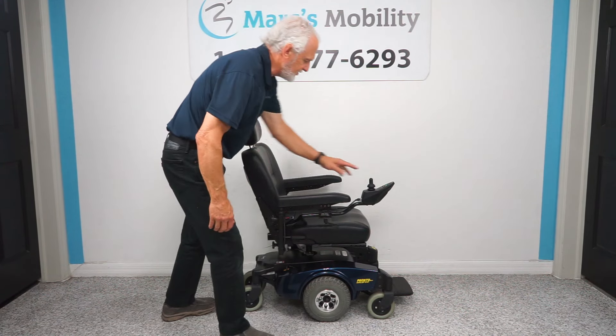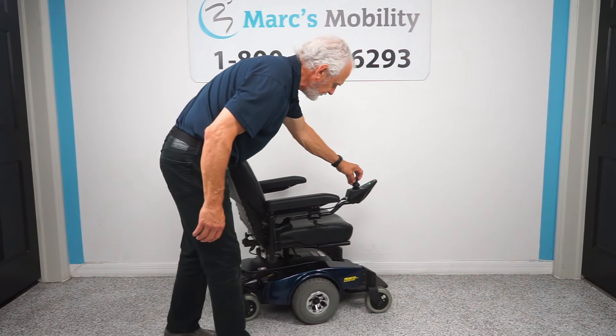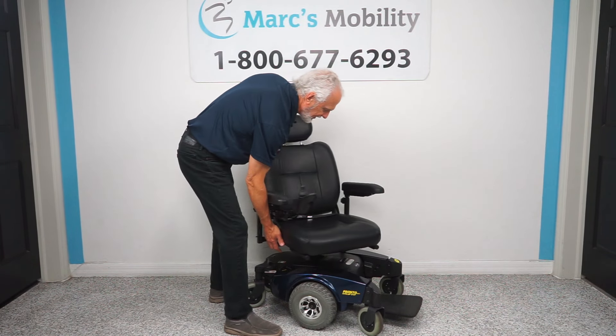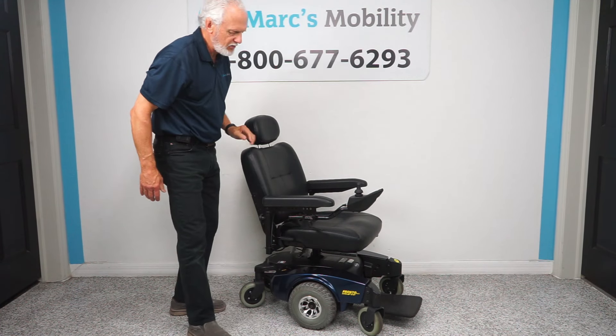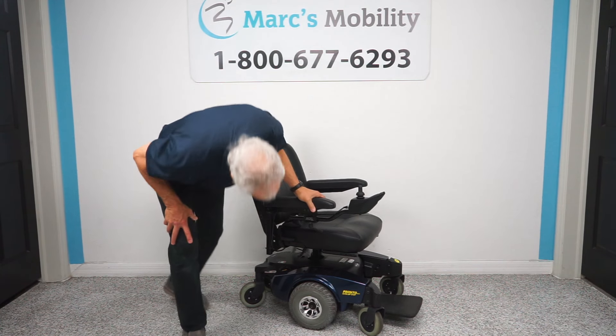The next thing that's nice about this chair is it has a swivel seat. You can swivel it either side and it'll lock when you get there.